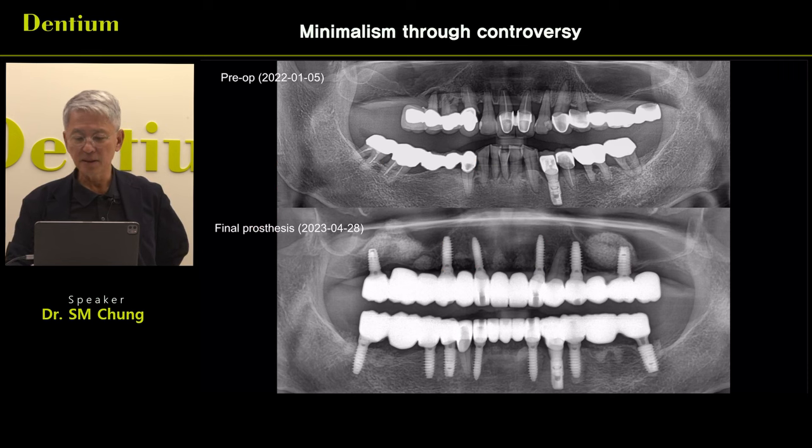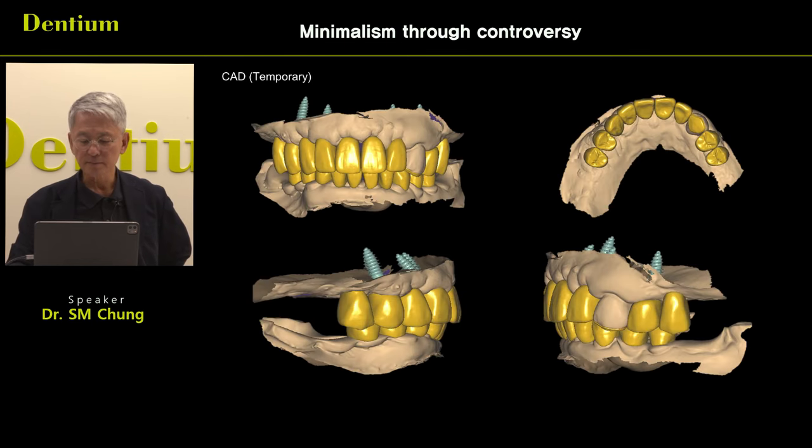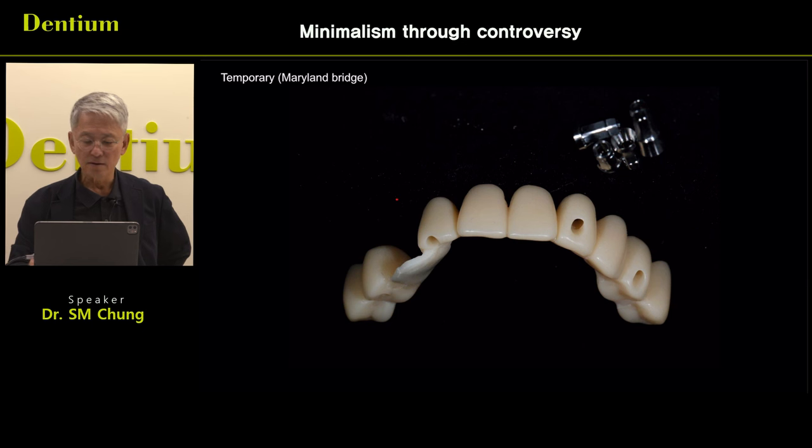In these patients, after extraction of most of the teeth, we place the implants in the upper and the lower together. And there is one natural tooth that acts as some stops. Sometimes when there is some natural tooth, we can make a stabilization all together, milling some resin to cover the natural tooth with a little bit of vertical height increase.